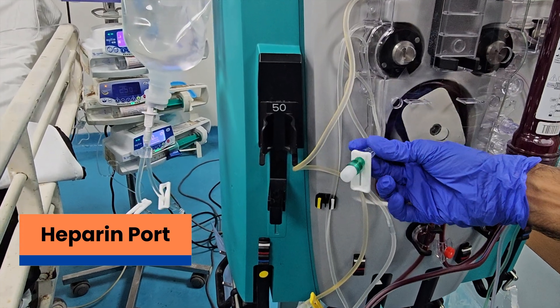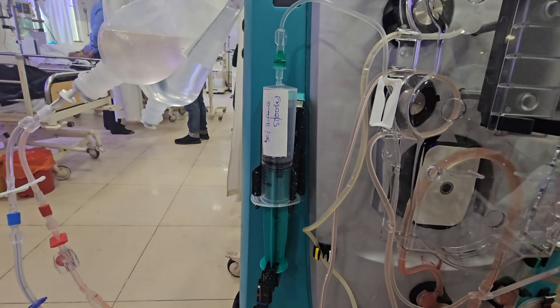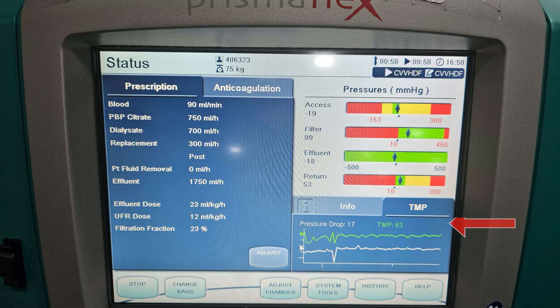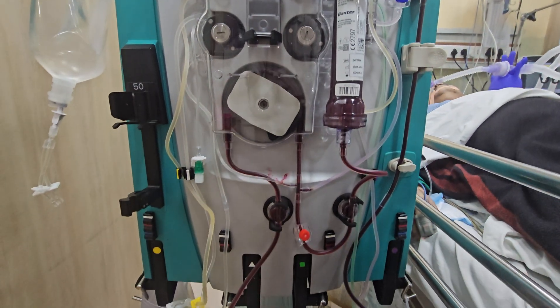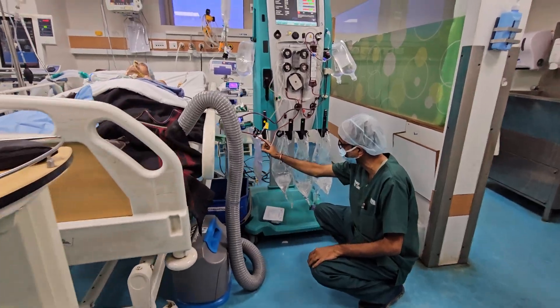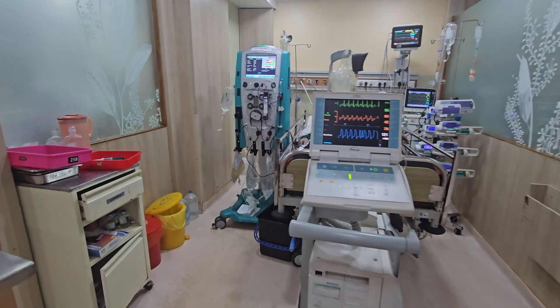Green port is connected when heparin anticoagulation is used. Gradual rise in transmembrane pressure is observed. There are two ports for blood sample collection: pre-filter and post-filter. During CRRT, the volume of all the bags is checked frequently.